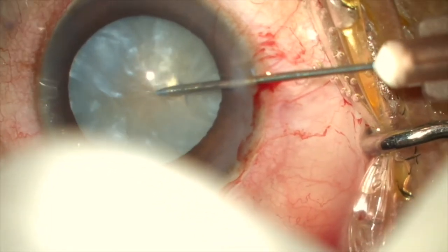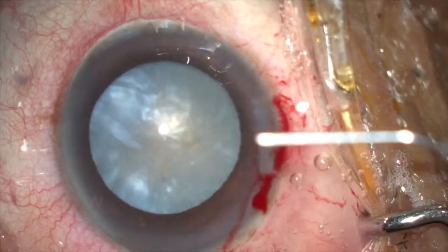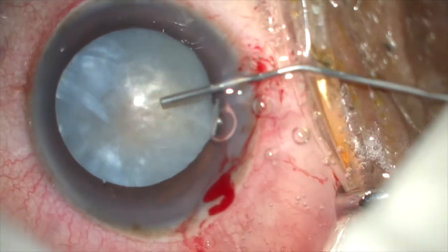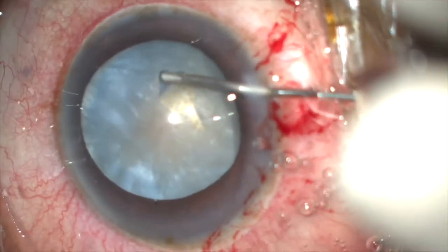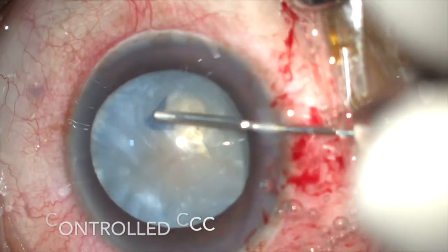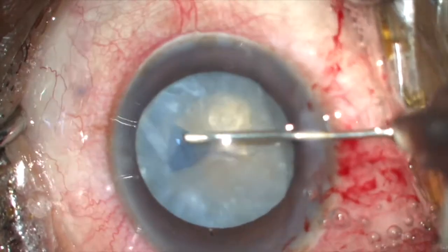Once you aspirate the liquefied cortex, try to tap the lens so that fluid trapped beneath the nucleus comes out anteriorly. Once the aspiration is done, the nucleus and the anterior lens capsule behave like any other cataract, helping us to get the desired size and shape of the rhexis.